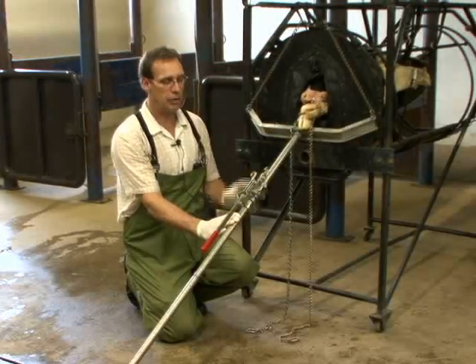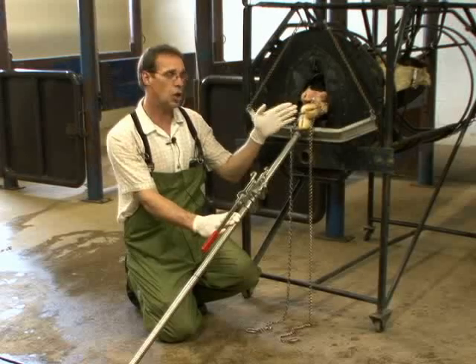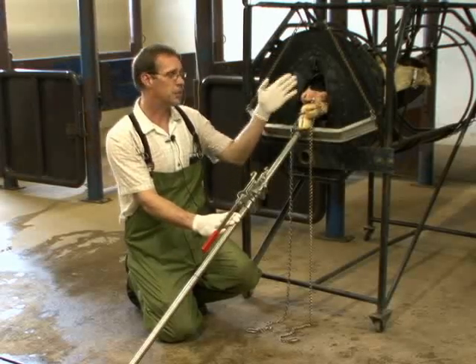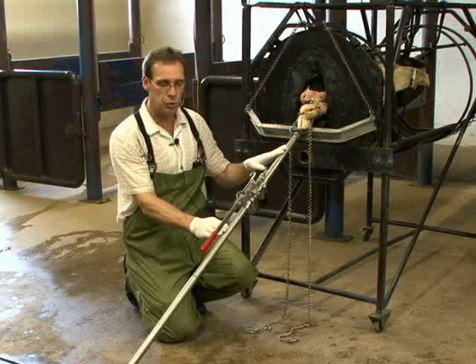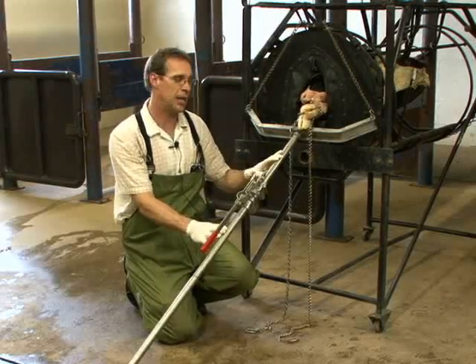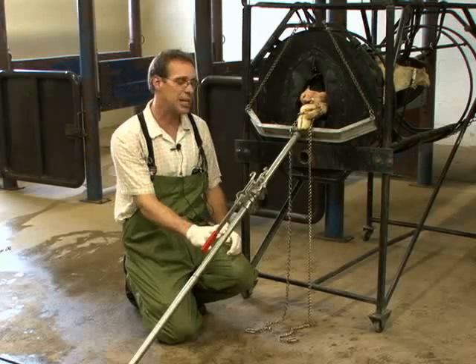The amount of force the calf jack can deliver can be quite extreme and can cause a tremendous amount of problems to the cow — problems as severe as tearing of the birth canal or even paralysis of the calf's hind legs. So when we choose to use the calf jack, we have to be very careful and understand how to make it work without causing any damage.